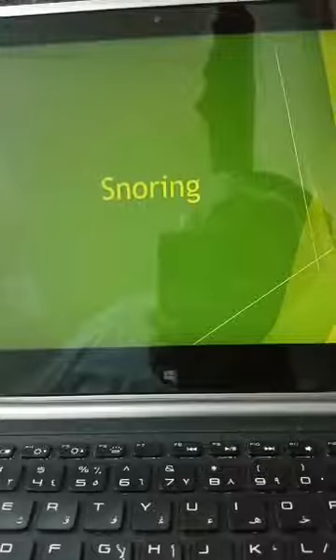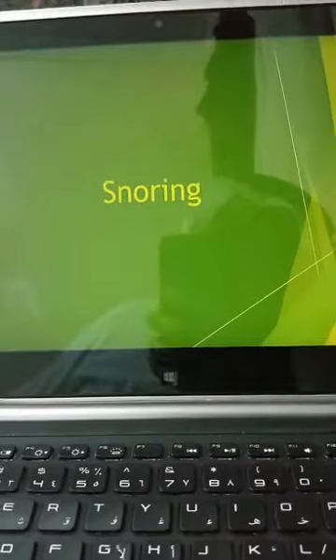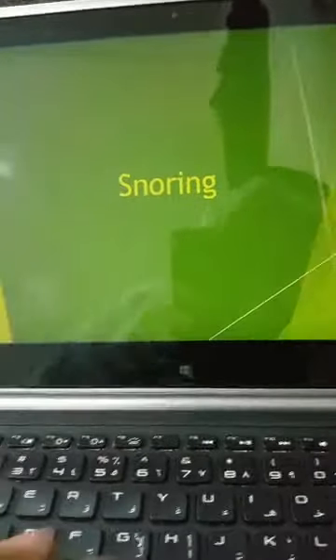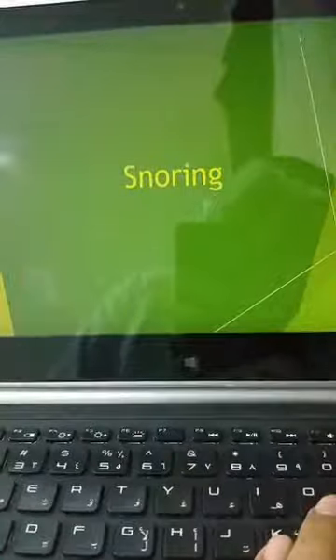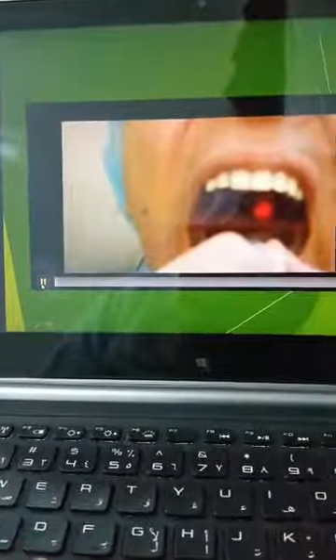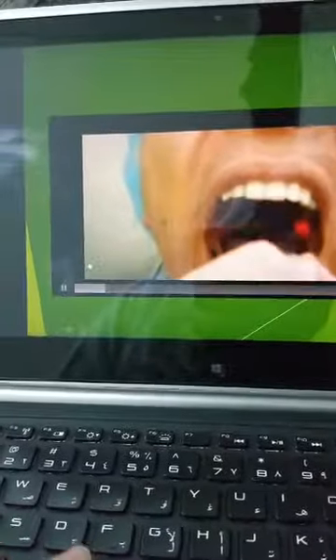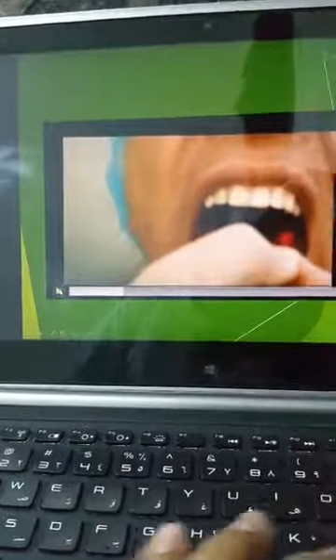And now we are introducing to dentists a new aspect of treatment, that they can know better than any doctor in the medical field. Of course, they are dentists in medical. By a low level interaction using the laser. For instance, you apply the laser like this.